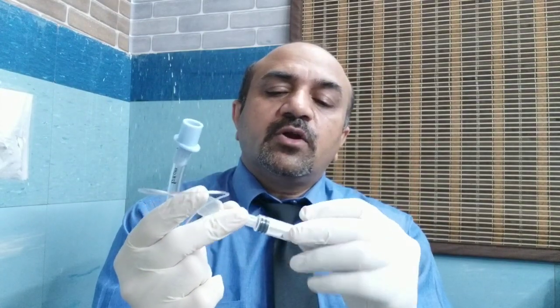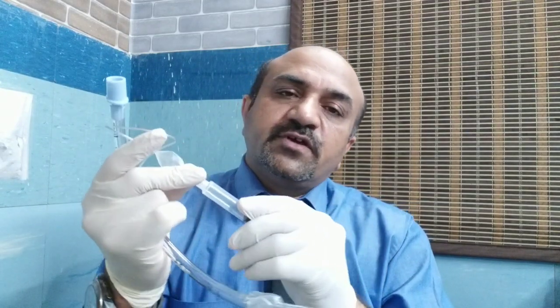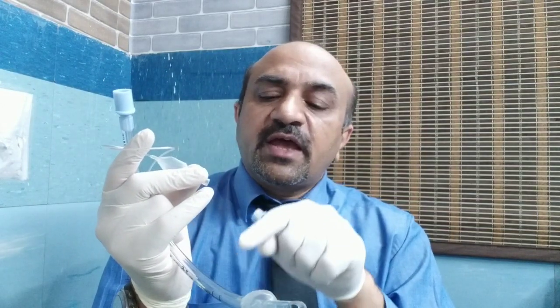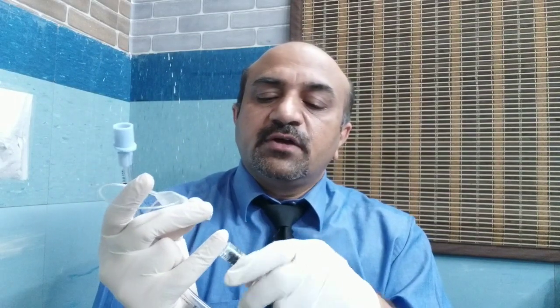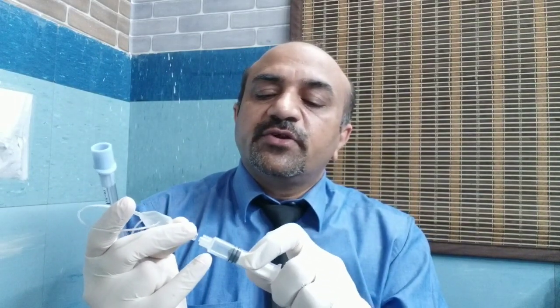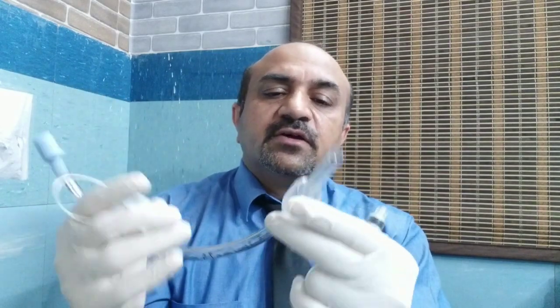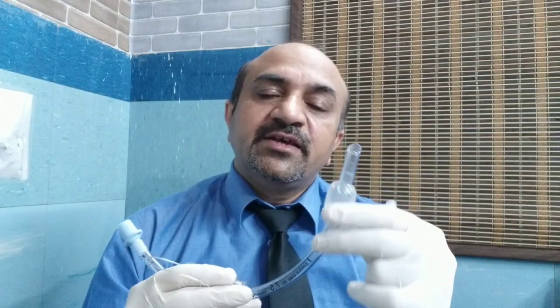It has a lock where we can inject the air. So we'll just fix it and we can inject some air. The idea is to put in as much air as the number of the tube. For example, if this is 7.5, which is the internal diameter of the tube, then I'm going to inject 7.5 ml of air. Now this balloon is inflated. We can check its patency. What is the role of this balloon? It won't let the secretion go down, and it will also avoid any leakage from the airway to the outside.